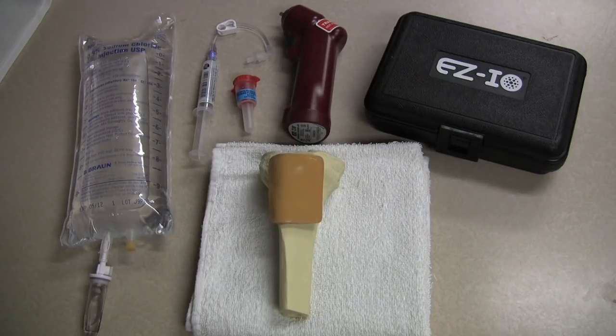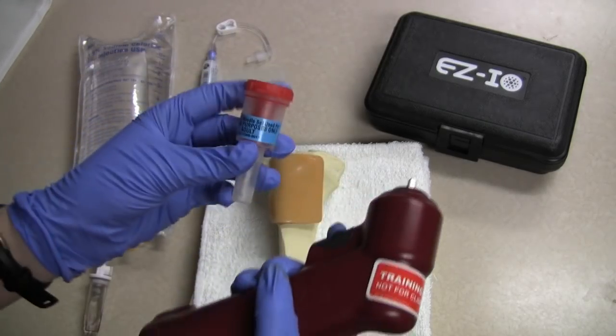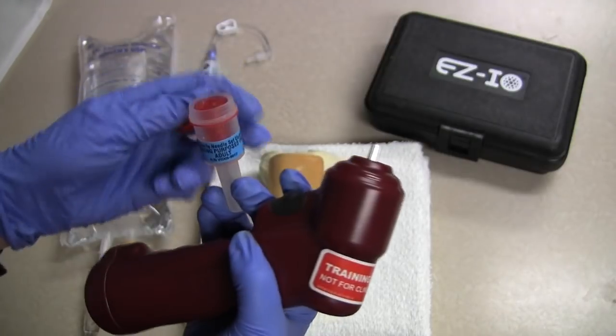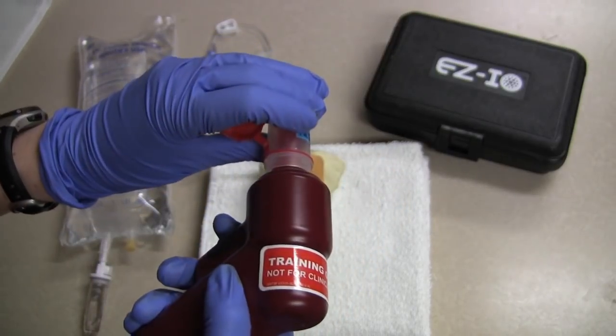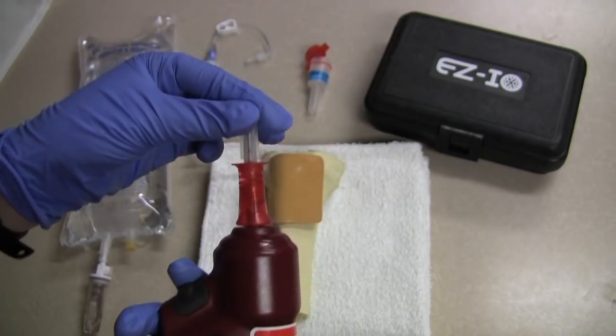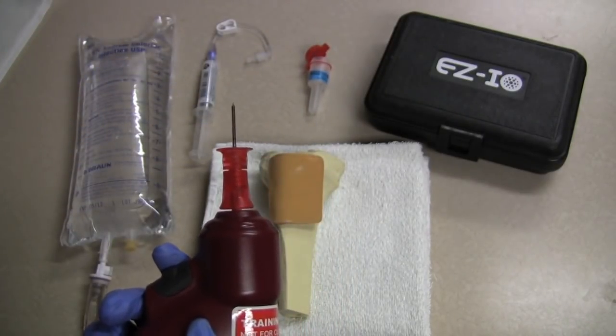So we are ready to begin. I will get the drill and the needle — it is an adult needle, I am rechecking it. What is really neat is this needle magnetizes to the drill. I will go ahead and take off the protective sheath.